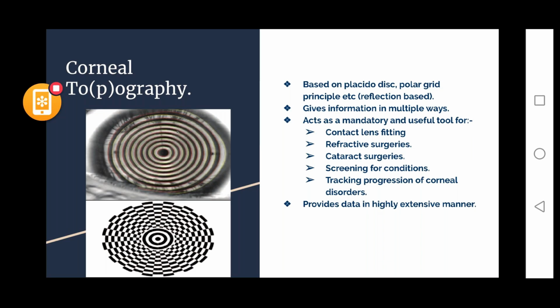Now, how does topography help? When do we use topography? The most common application for optometrists would be contact lens fitting. If one of you is a specialty contact lens fitter, you understand the value of a topographer in your practice. If you can fit contact lenses based on the topographer, you're one of the best fitters. Secondly, for the surgeons, it is for refractive surgeries.